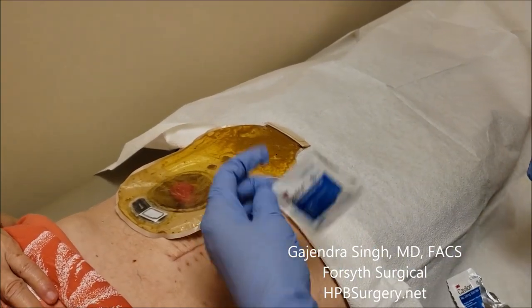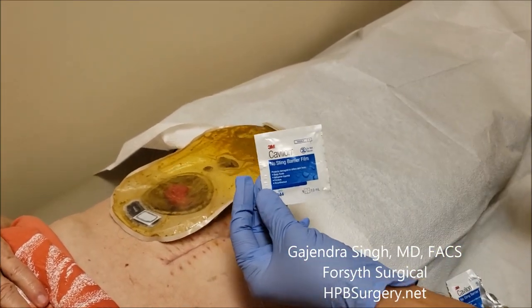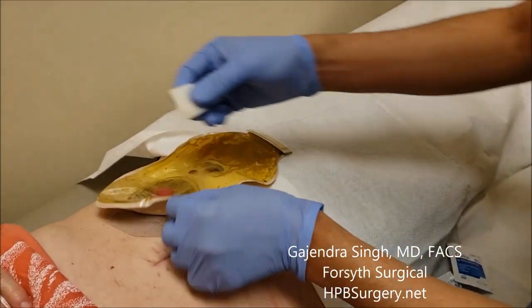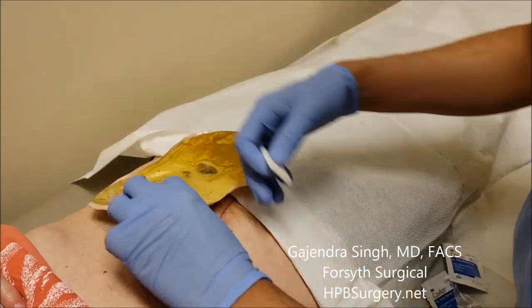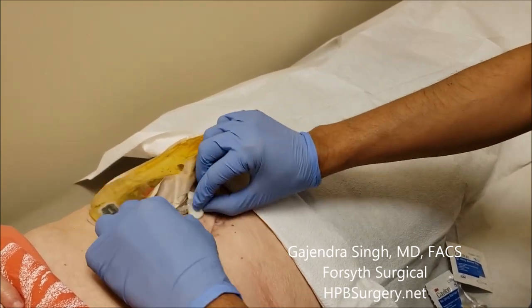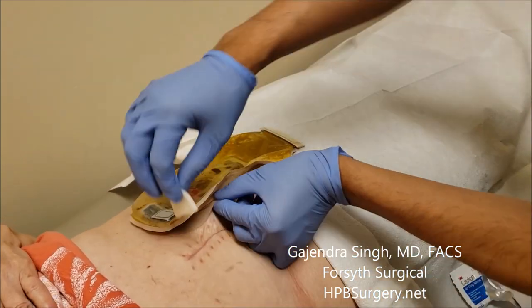These wipes come included with the colostomy supplies. You can use them to help take the bag off easily so the skin doesn't get irritated. Apply a little of the foamy stuff, start from one side, and the bag comes off very nicely and easily.